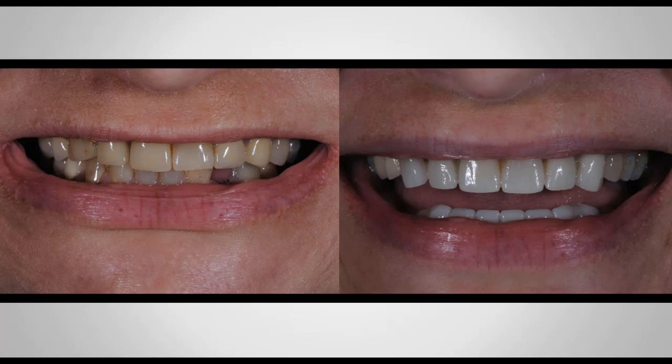Now, this is immediately after I've completed all anterior teeth. And this is how I send my patient home. Why do I do this initially? Because if I don't have any posterior contact, and she had one side that was very tender, now I know that I have all these anterior teeth touching at the same time and with the same intensity, with no posterior teeth in contact. So I know I don't have any posterior interference that may cause those muscles to maintain that tenderness or that contraction that they have at this point.